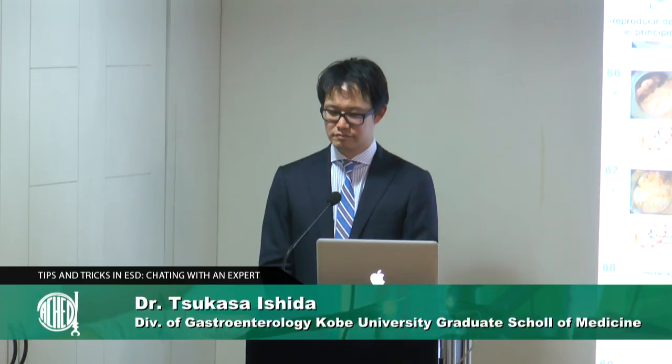And I think that maybe the swift coagulation mode is more effective than forced coagulation mode, because force makes the fat tissue explode against the lens. Yes. So maybe yes. Swift also could be a tip. Yeah. Oh, okay. Thank you very much.